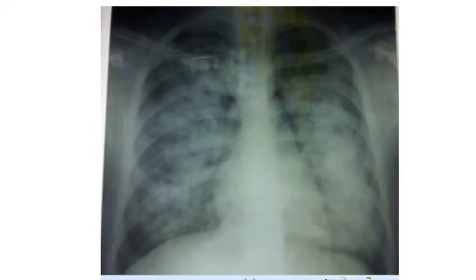And I don't know whether you can see, it's about 2.5. No, it is not there. I won't agree with you that there's a right atrial enlargement. There is no cardiomegaly. There is no significant chamber enlargement which could be detected by a plain X-ray.